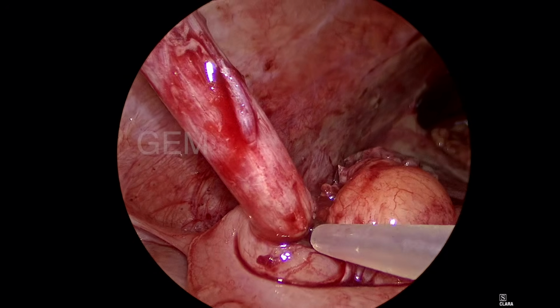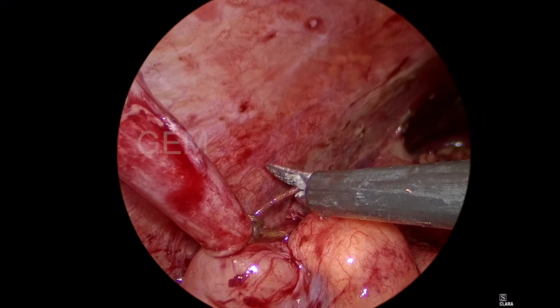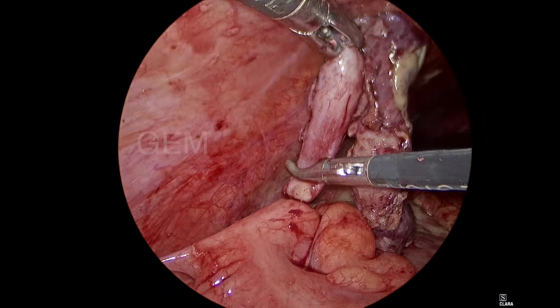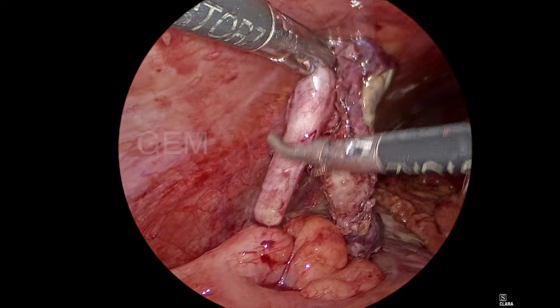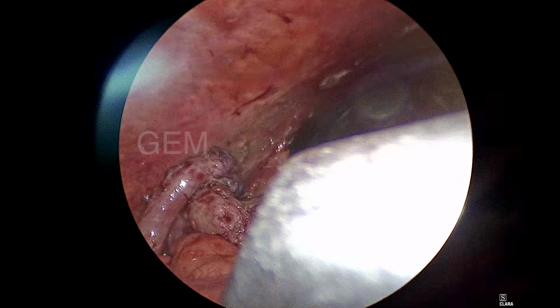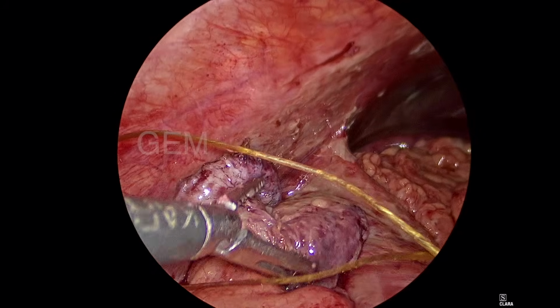So the catgut loop is applied to the base. The first loop is just for occlusion, don't tighten it very much, just snug is enough. Again I am milking it out. The content will go to the body of the appendix. So I am applying the second loop. So this is our practice.